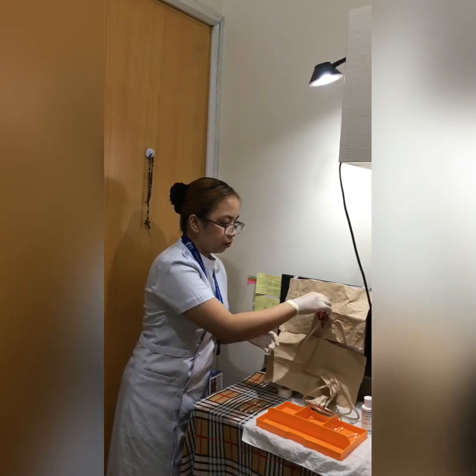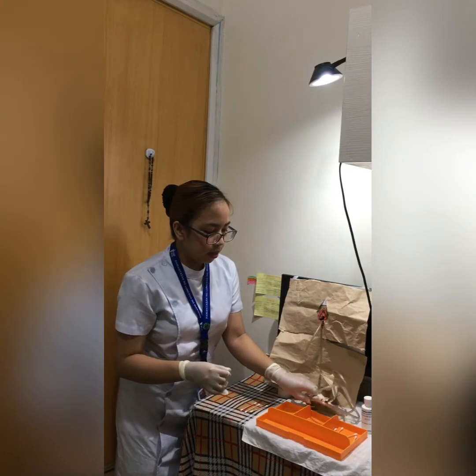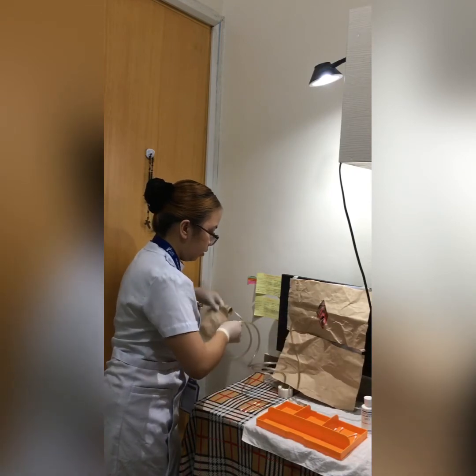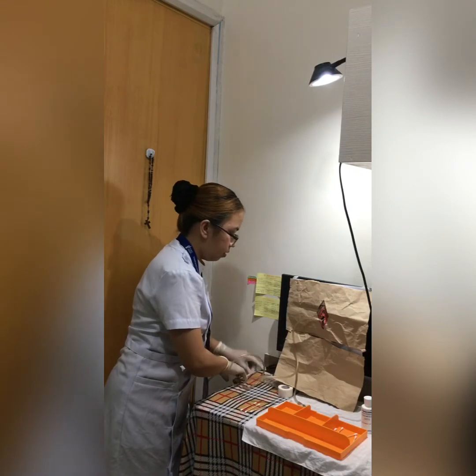Next, we're going to place the catheter bag on the side, lower than the client's bladder.